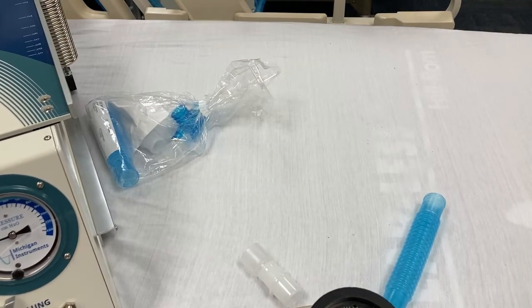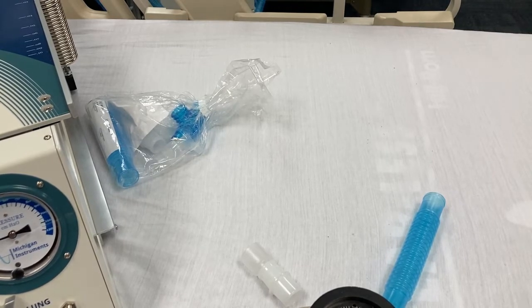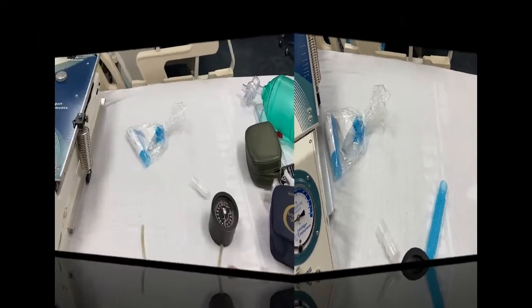So you're looking at what you measured the first time. You got your respiratory rate and your tidal volume, so you can already make that calculation without doing anything else. All right, so that is the parameter kit. Now we're going to move to the ventilator. I want to make one more point here.